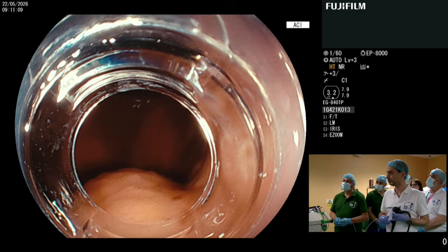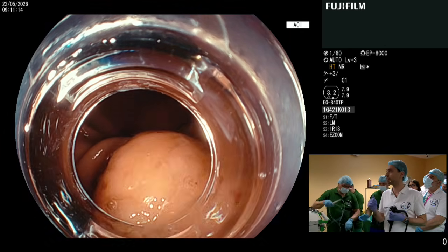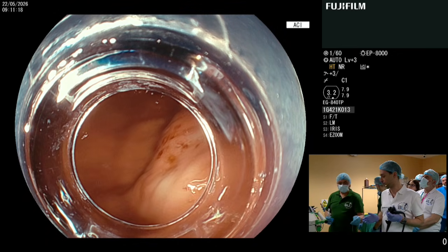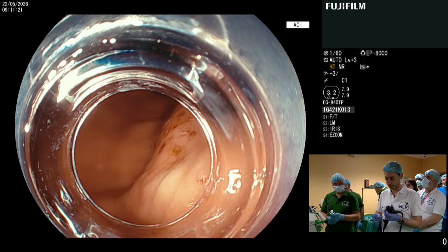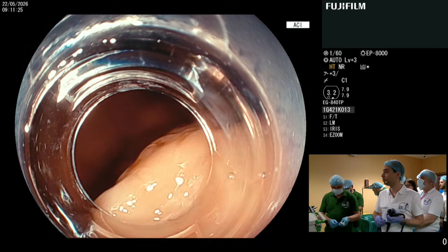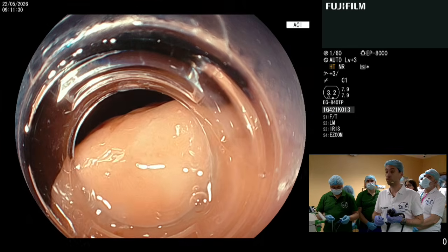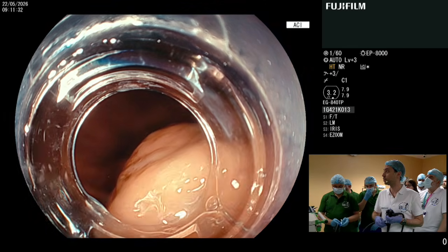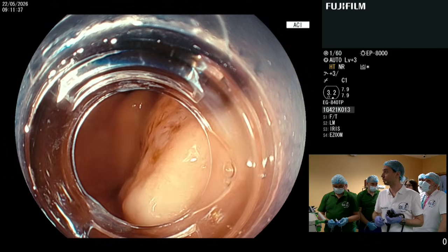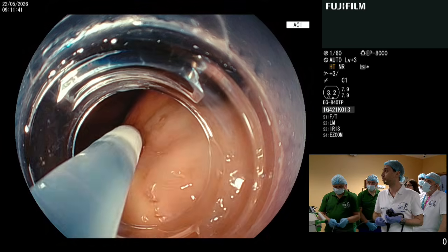Very good question. So ultrasound has to give us two answers. First of all, to tell us whether it's leiomyoma or not, in order to know whether we have to be very aggressive or not. Second is to determine the connection of the lesion with the muscle layer or the serosa and identify the component of the lesion that goes outside of the serosa. In this case, probably we will provoke an intentional perforation. So we should be ready for that. And also have a surgeon as a backup.